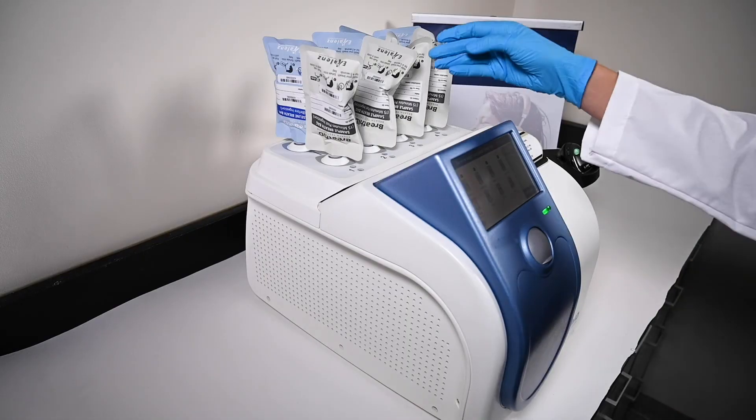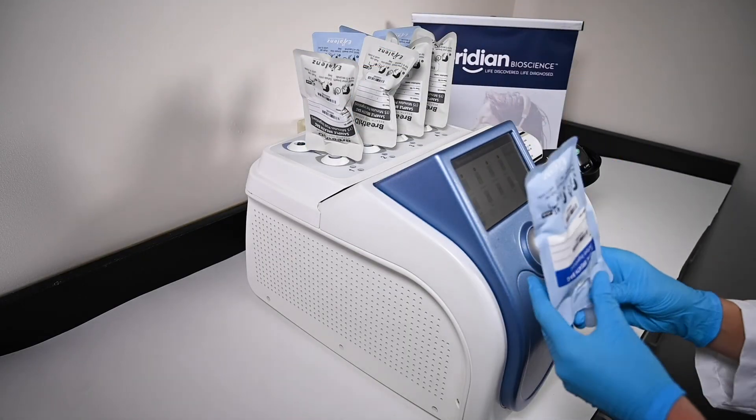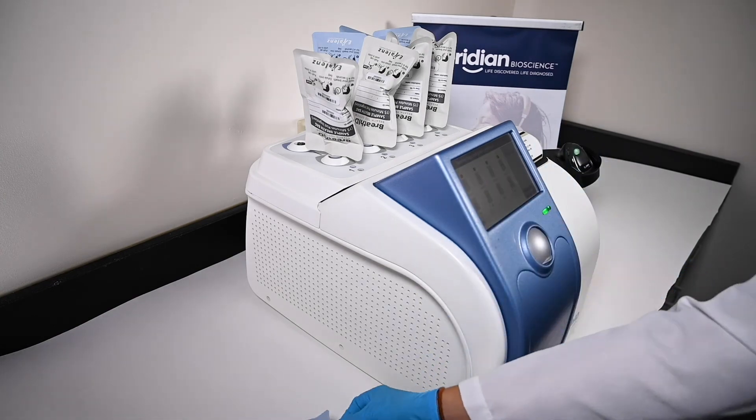Once the run is complete, simply remove the bags and recap the specimens, especially if they'll be used as controls later.